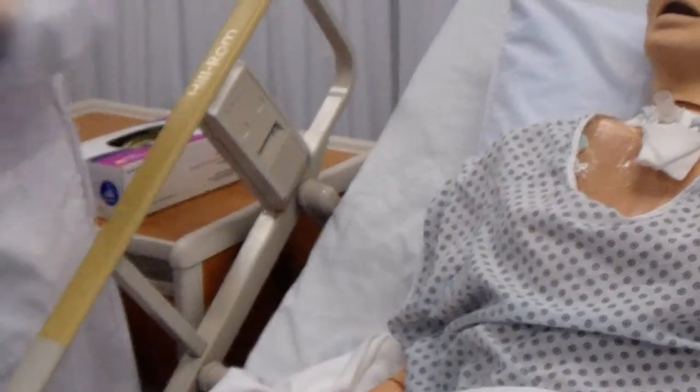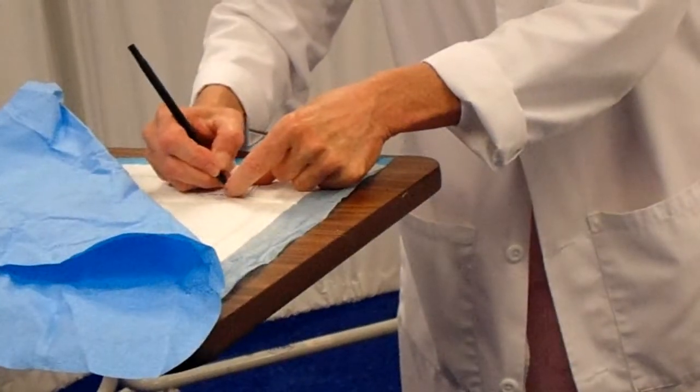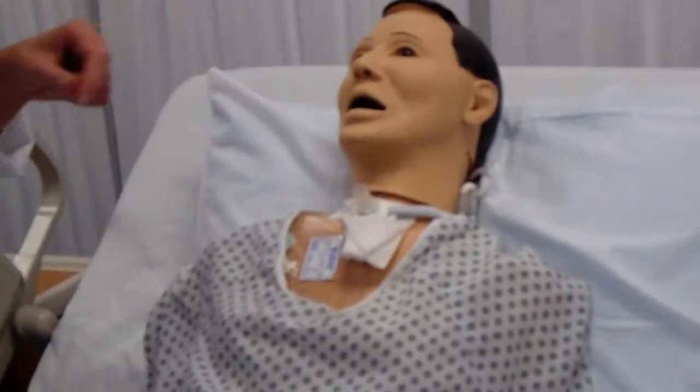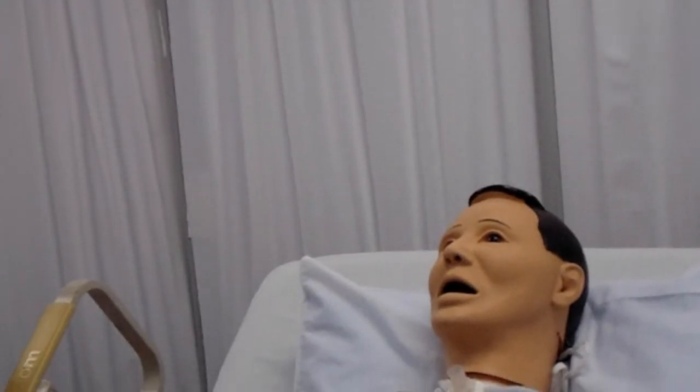Remove my gloves. Perform hand hygiene. And label the catheter dressing. Changed. Date, time, and initials. Right there where we can see it. All right, here's your call bell, right here on the side rail. Give a call if you need anything, all right? Patient verbalized understanding. Now I'm going to go to the chart and document my actions. The end.